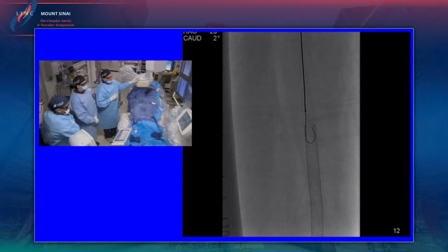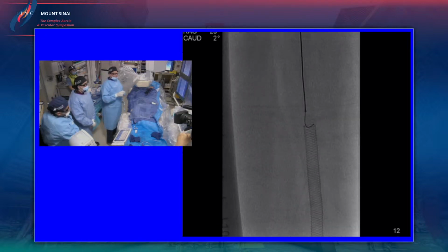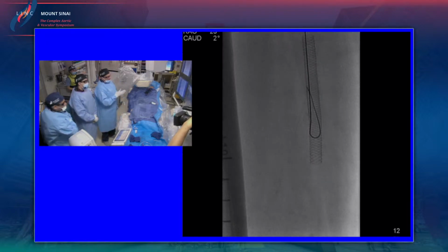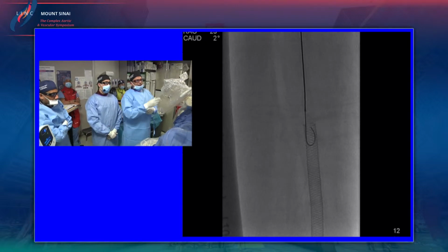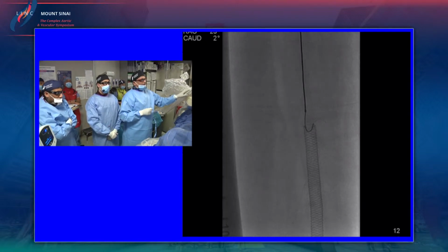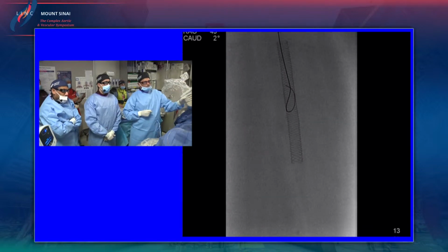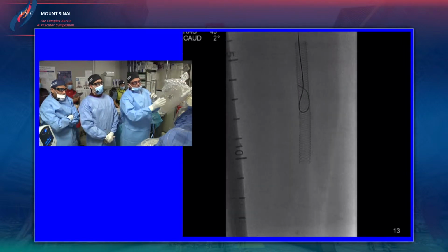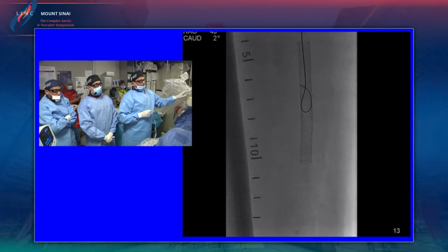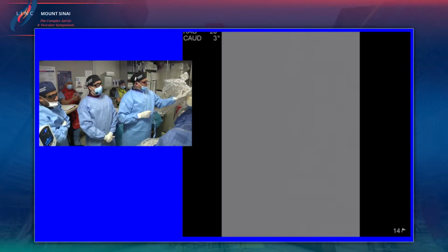So here what we did was we stopped proximal, and we used the prolapse wire technique because the Viance kept getting underneath the Supera stent. So rather than stick the stent here, we said, let's just try this. And Dr. Kapoor actually did this, and was able to prolapse the wire within the stent. At this stage, once we got the prolapse wire within the stent, it's always important technically, for everybody in the audience, to do multiple views to make sure that you're not behind any of the stent struts. We weren't behind any of the stent struts, so then we went ahead and confirmed our position distally.